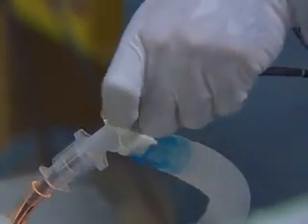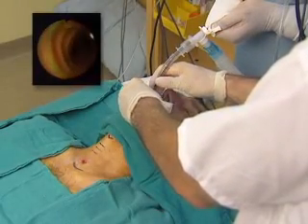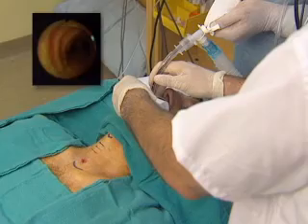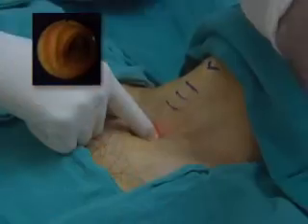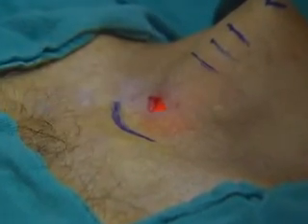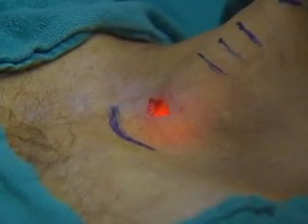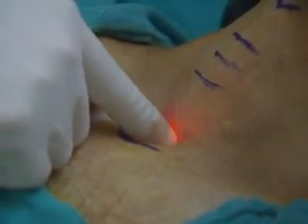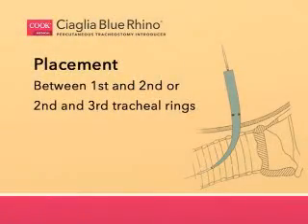A bronchoscope is then inserted through the endotracheal tube and aligned with the tube. The respiratory therapist then loosens the fixation tapes of the endotracheal tube, deflates the cuff, and withdraws the ETT and bronchoscope slowly as a unit until the light from the bronchoscope transilluminates through the incision. Necessary changes in tidal volume and frequency should be made to accommodate the bronchoscope and any air leak that may occur during dilatation.